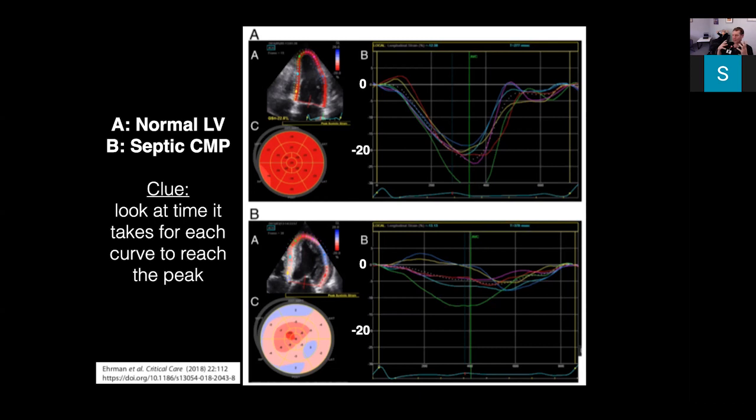The theory being, and again, I steal this idea, if you look at something like a vortex, the heart contracts in a twisting fashion so that it can create vortices within the LV. If you have a heart contracting in a synchronized manner, you create a vortex. If you have a heart contracting in a dyssynchronous manner, you get a jumbled ejection of blood.